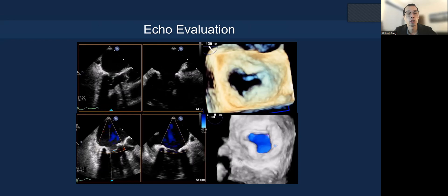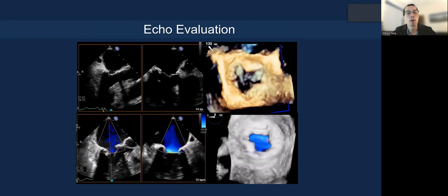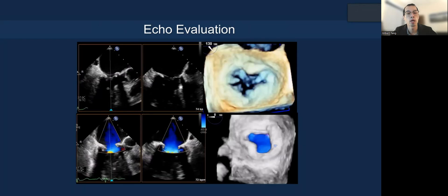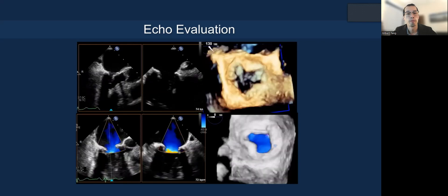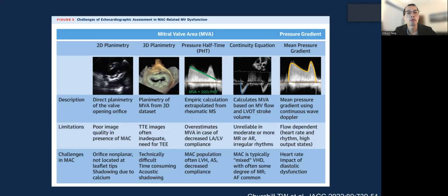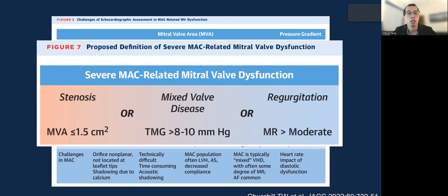Here's an example of an echo evaluation. You're going to be doing a bicommissural view with biplane to LVOT, quantifying the MR, and of course 3D en face as well. However, there are some challenges actually determining MS severity and also MR severity in MAC. This JACC paper shows some of the challenges involving planimetering the valve area, pressure half-time, determining the gradient, continuity equation, and coupling the mean pressure gradient. They propose severe valve dysfunction in the presence of MAC as valve area for stenosis less than 1.5 cm², high gradient 8 to 10, and at least moderate or greater mitral regurgitation.